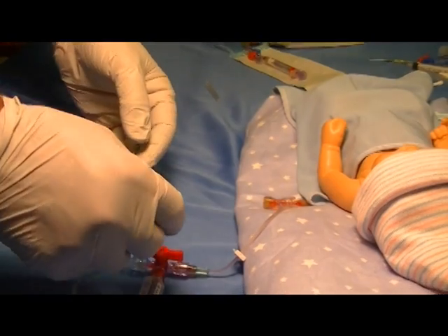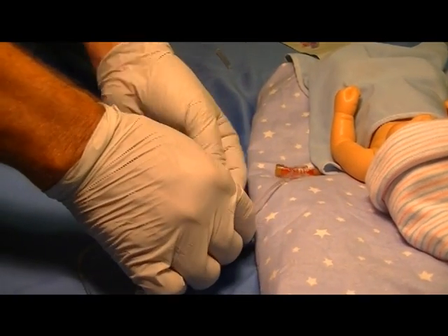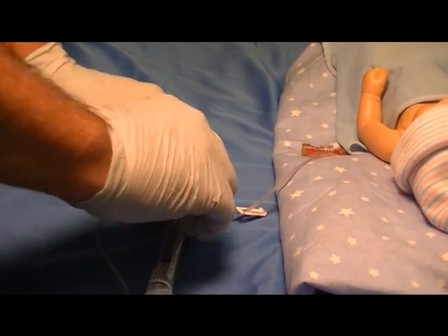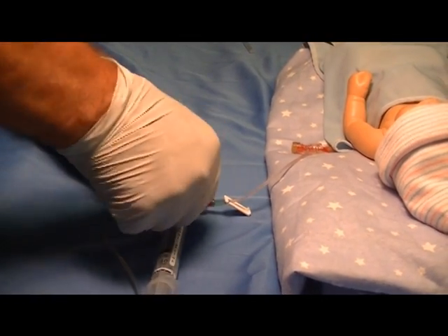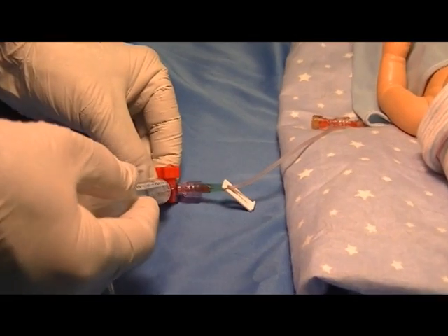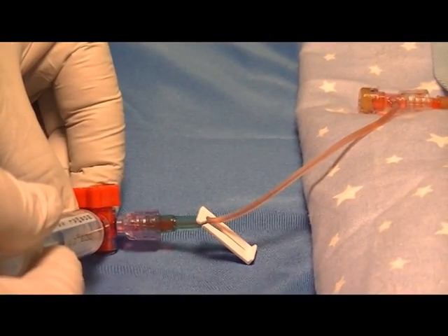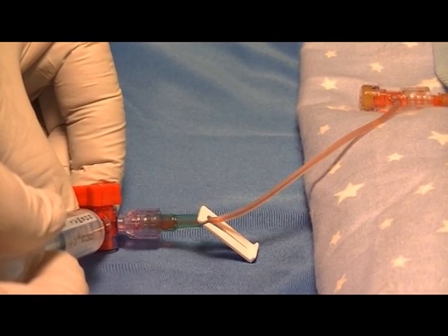Now you need to unclamp the line and go to your flush syringe attached to the T-connector and give approximately 0.3 to 0.5 of flush to clear the catheter.